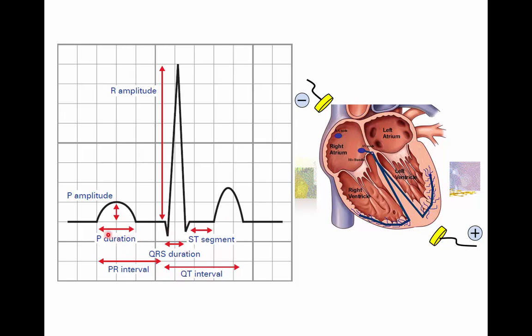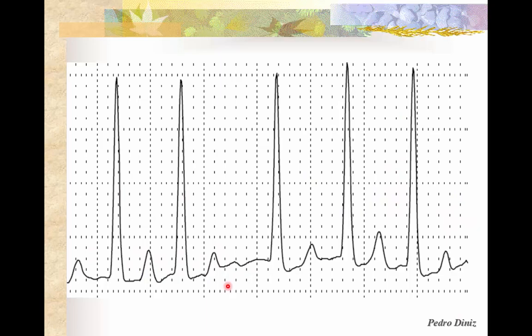Waves on ECGs are not that difficult to identify once you get familiarized with their format and morphology. The first wave we have is the P wave, followed by the QRS complex and the T wave. However, in some circumstances we might have ECGs where P waves and T waves look quite similar and may not be easy to identify in a given trace.